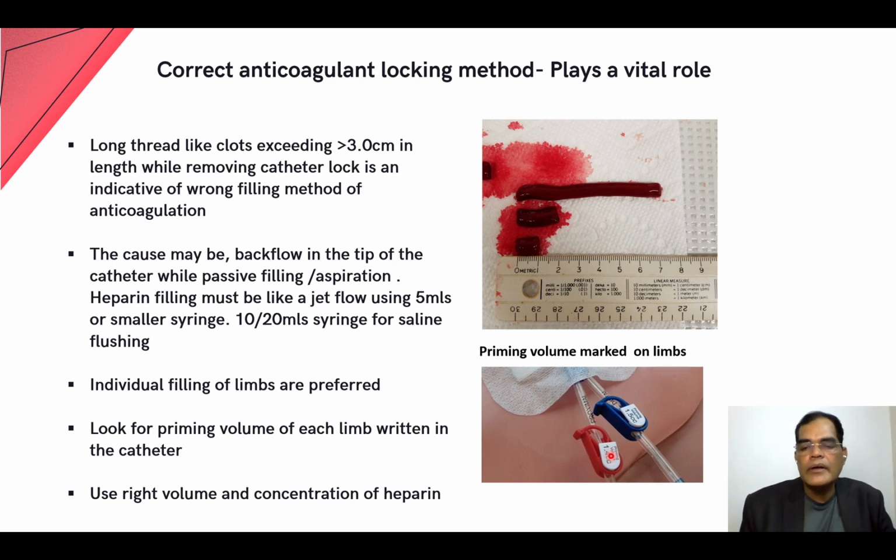So accurate filling or optimal filling will be there, or otherwise it may be underfilled or overfilled, which may go into the circulation. So use the right volume and concentration of heparin. That's the thumb rule for preventing clots in the tip of the catheter.